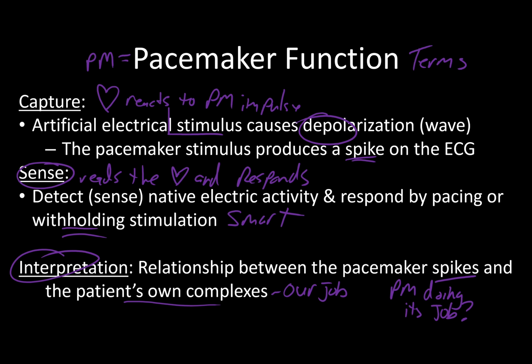And that's why talking about the classifications and things like that becomes important, because if you're going to figure out whether the pacemaker is working correctly, you really have to know what the settings are. That becomes really, really tricky, and pardon me, that's the deeper part. For now, just realize that capture, sense, and interpretation.